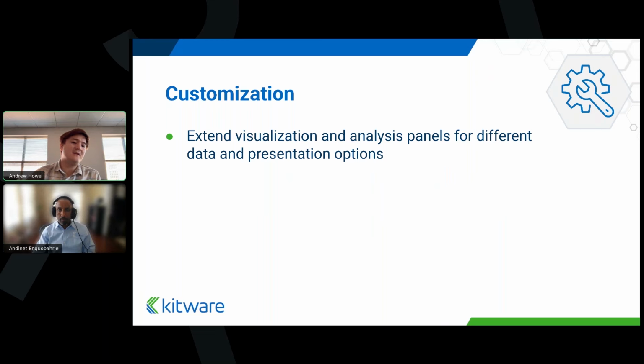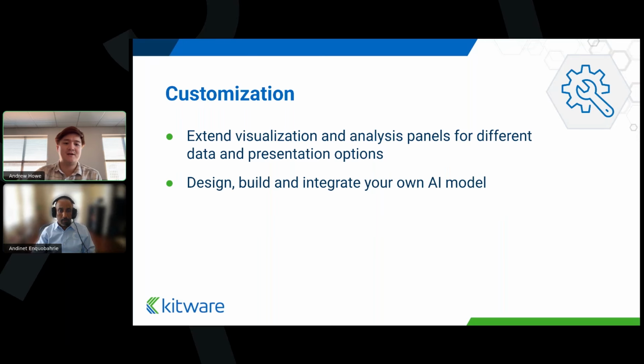And our goal is to really increase the speed of iteration for integrating these AI models into actual applications, because we have these very easily configurable endpoints. And VolView is open sourced. It's an open modular platform. So it means you can add your own data sources, plug in your own AI models, and shape the user experience as it fits.